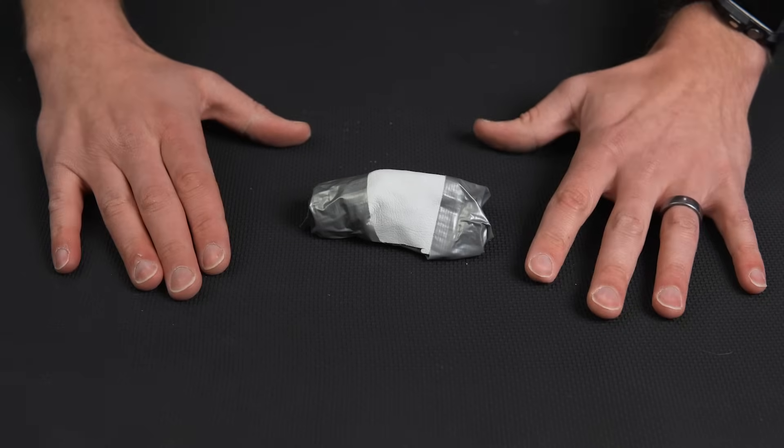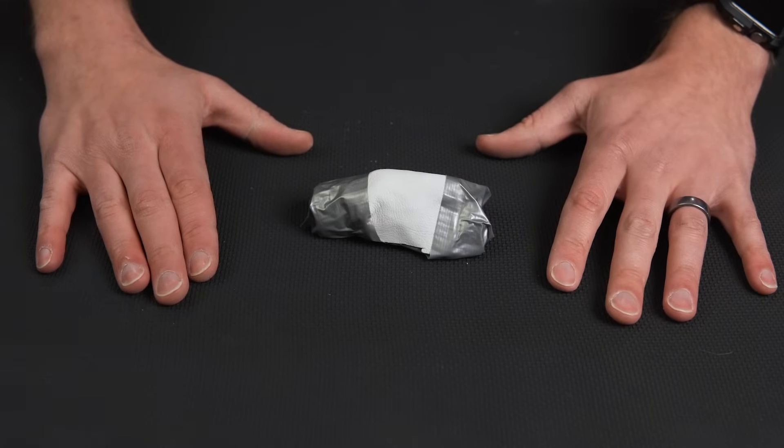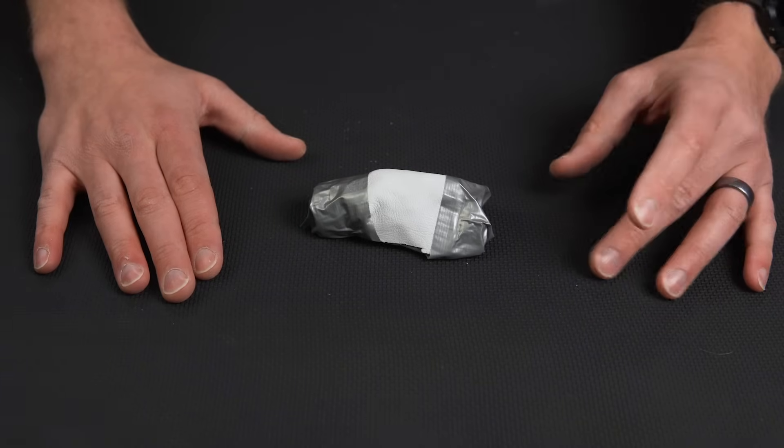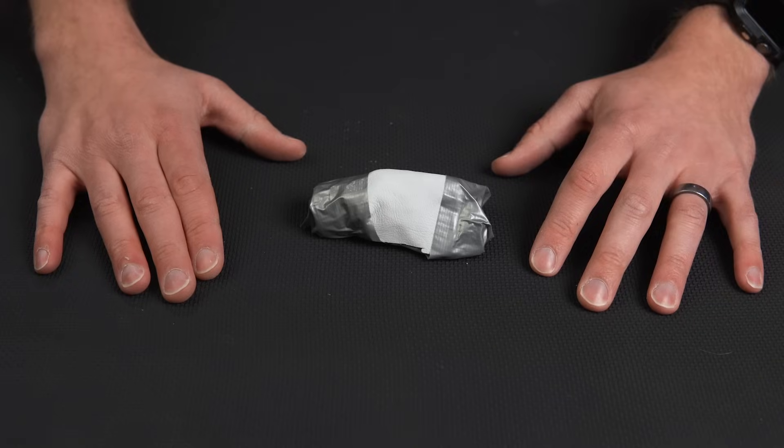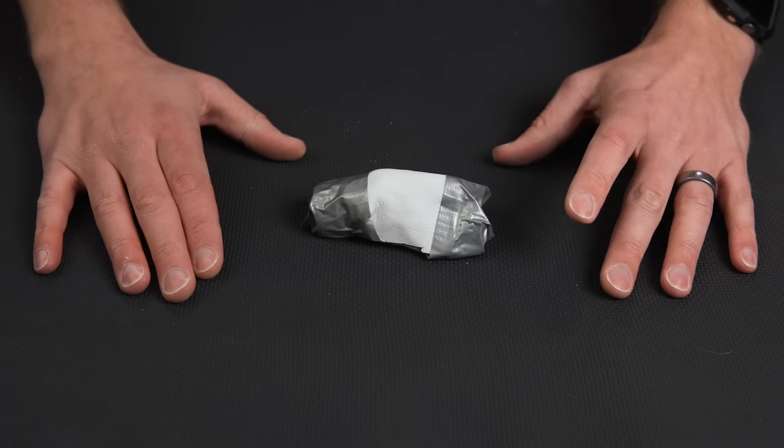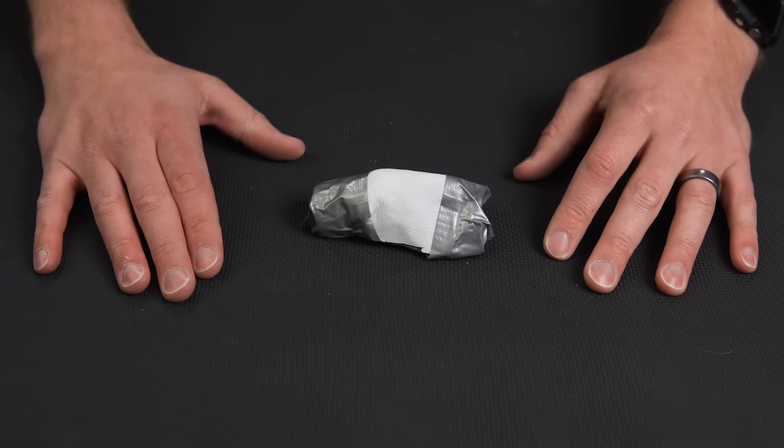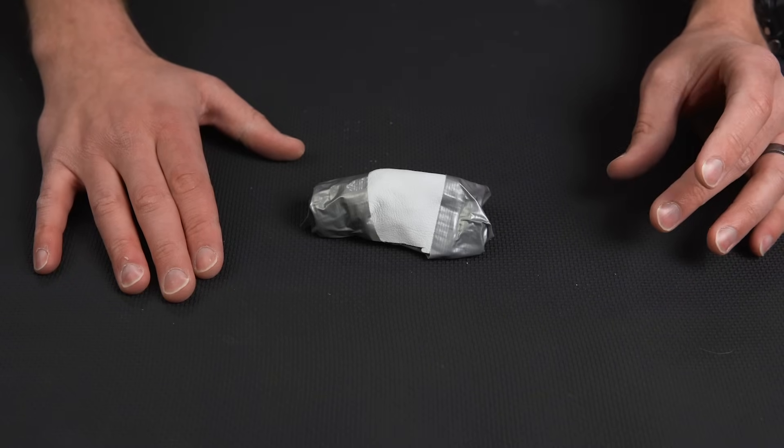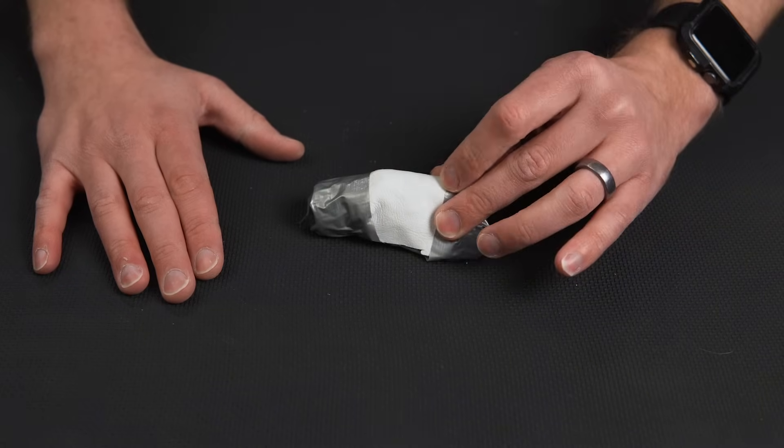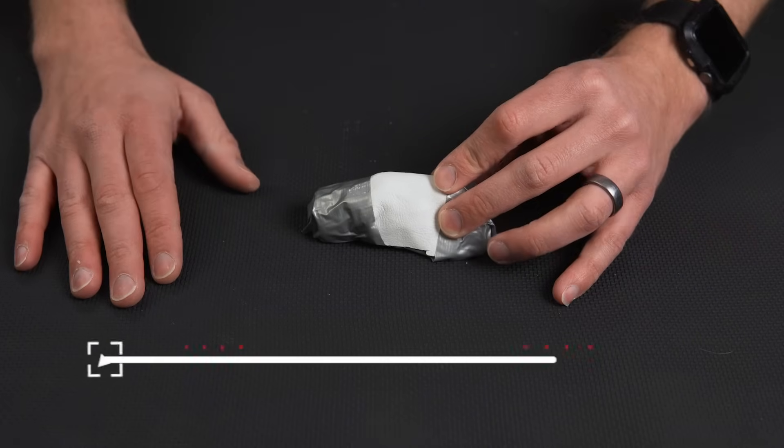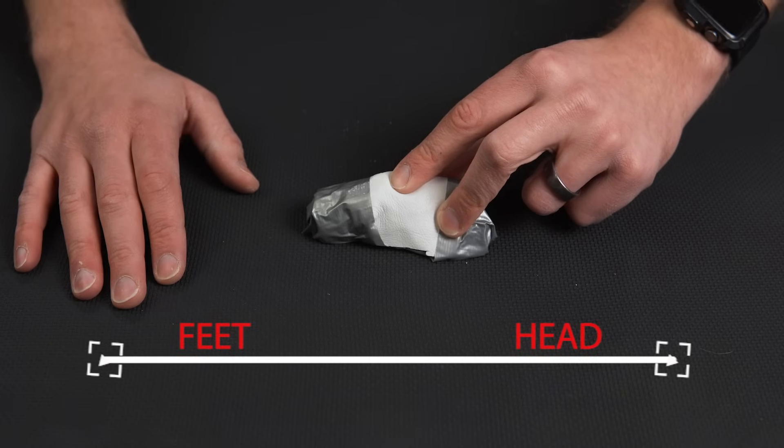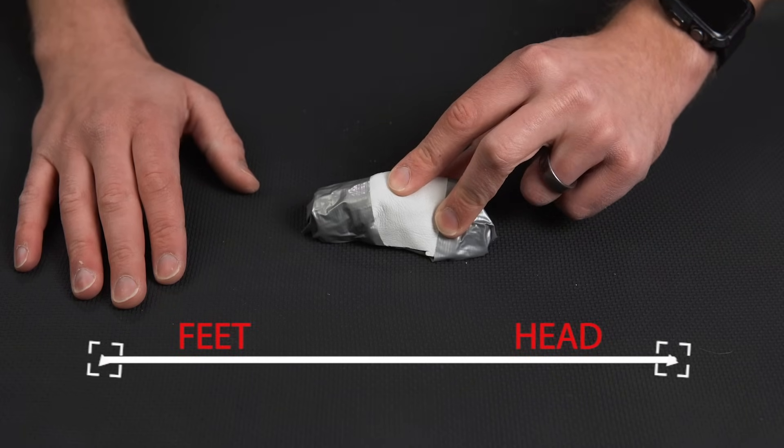The second technique is a simpler version of the first one. And this is actually how I was trained to perform this procedure on the helicopter. It is slightly more controversial though. For this technique, it starts the same. We want to position ourselves on whatever side of the patient we are dominant. We're going to find the thyroid cartilage here, and I'm going to palpate the prominence or the Adam's apple with my pointer finger, slide down and find my landmark for the cricothyroidomy, the cricothyroid membrane right here.